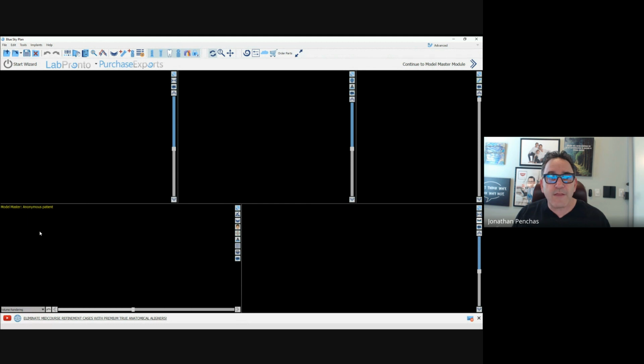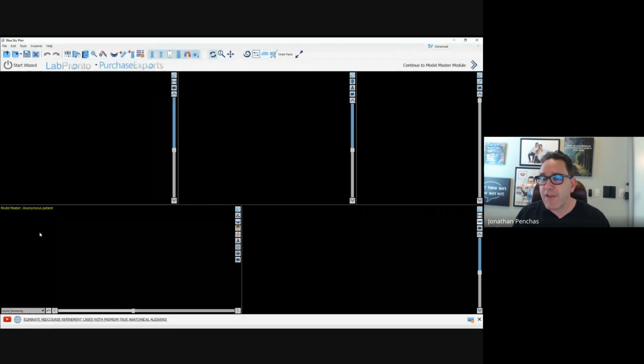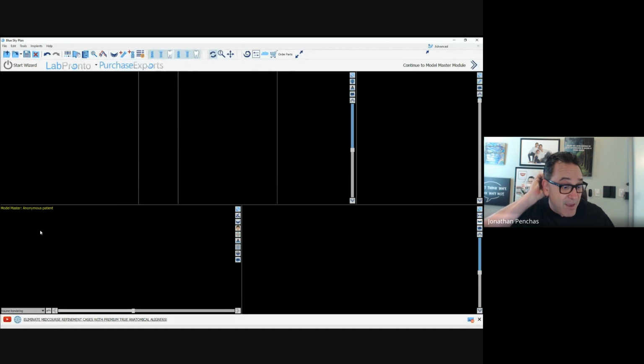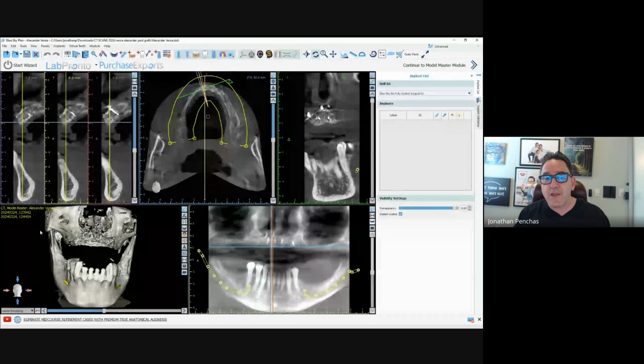And so as we save and open, you really need a very strong computer, basically a gaming computer or a much stronger workstation to do this. You can't really do this on a small laptop.